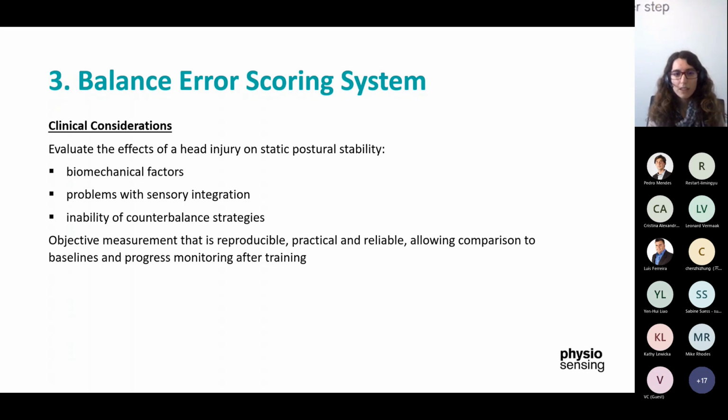However, biomechanical factors should not be completely excluded. Even healthy individuals can lose their balance in these conditions, in which vestibular information must be used to control the balance. Healthy individuals will show minimal sway on the firm surface with feet together, and on the other hand, sway increases on the one leg standing and tandem position, and mainly, of course, in the case of the foam surface. Even healthy individuals may lose balance or fall in these conditions.